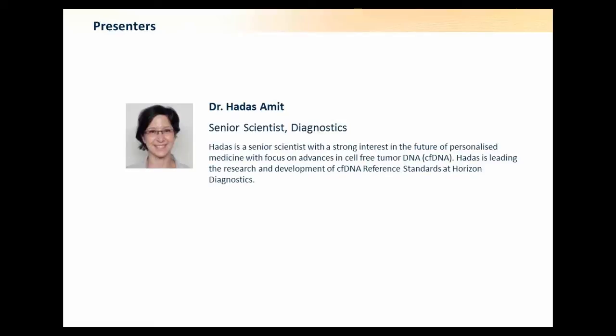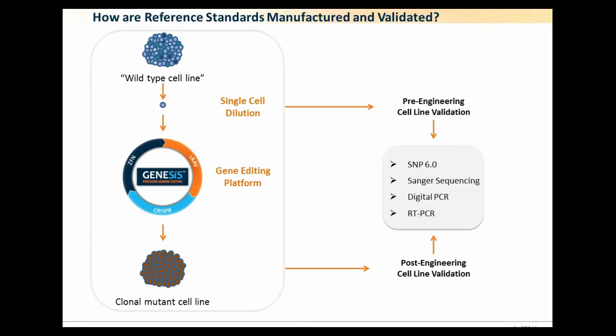Hi, hello everybody, and thank you for hearing us here today. So I'll talk you through how we actually manufacture reference standards, and then dive into 2 case studies highlighting the use of references to assess the sensitivity and specificity of cell-free DNA monitoring on different platforms, including next-gen and PCR-based methods as well.